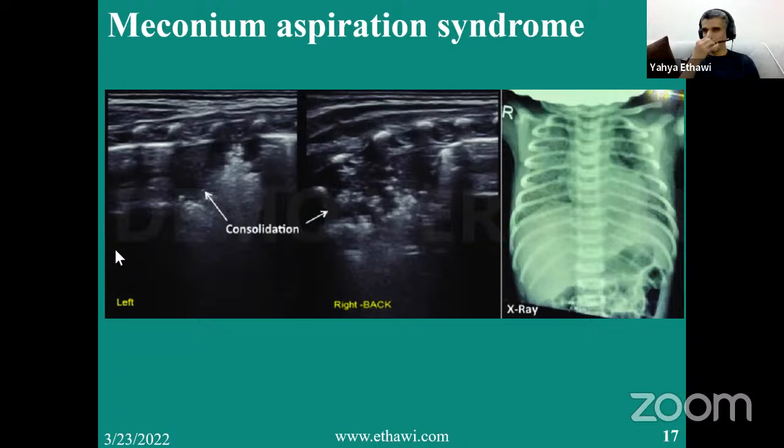If you're not busy and the baby is stable, you can do whatever you like. But usually in ultrasound, I take 5 minutes to do it, maybe less. If you do everything, you might get 10 minutes, 20 minutes. For the learning process, you can do that. But with time, you'll have a specific question to answer. So when you get your answer, you don't need to continue. That's usually what I do.